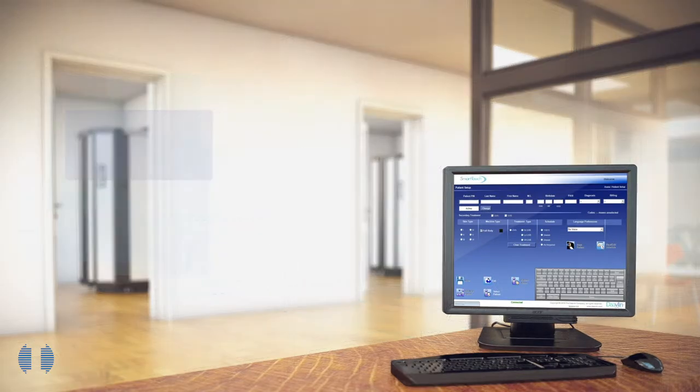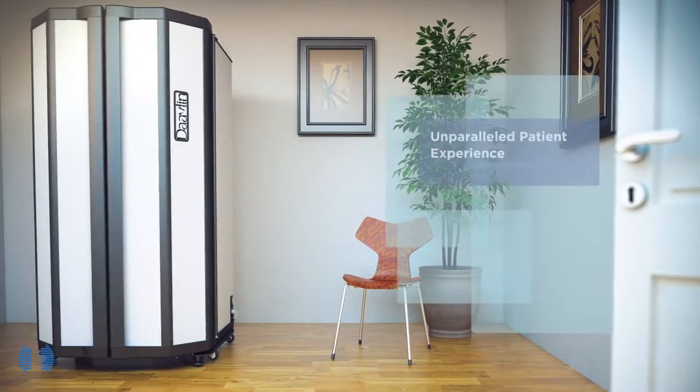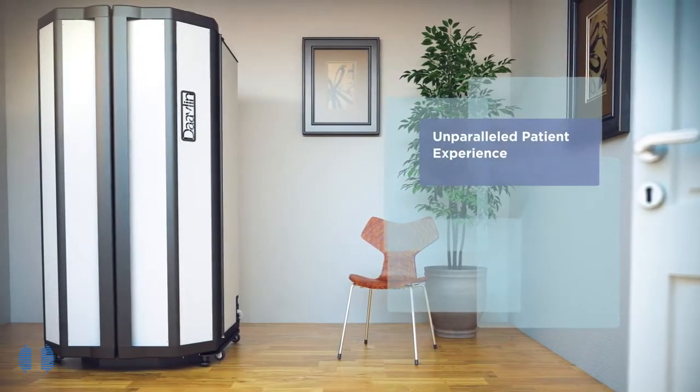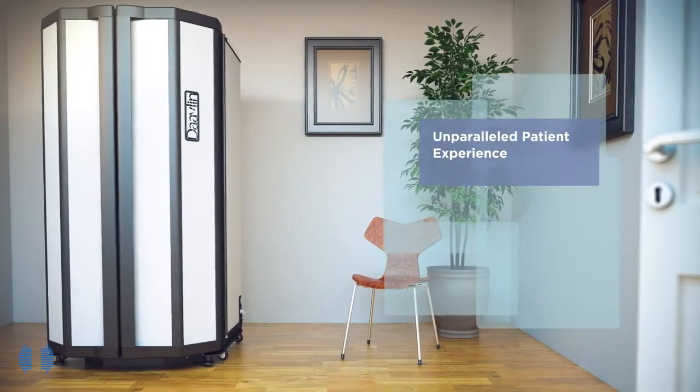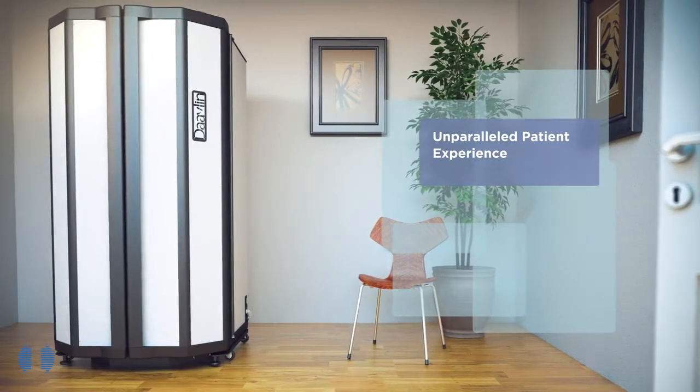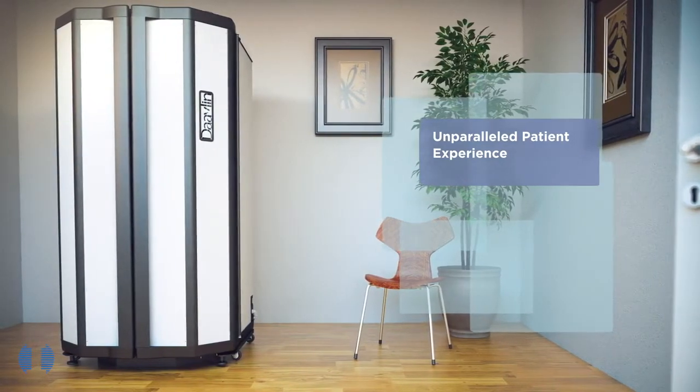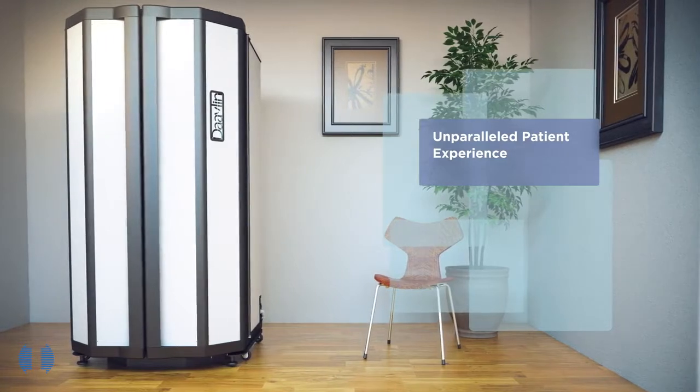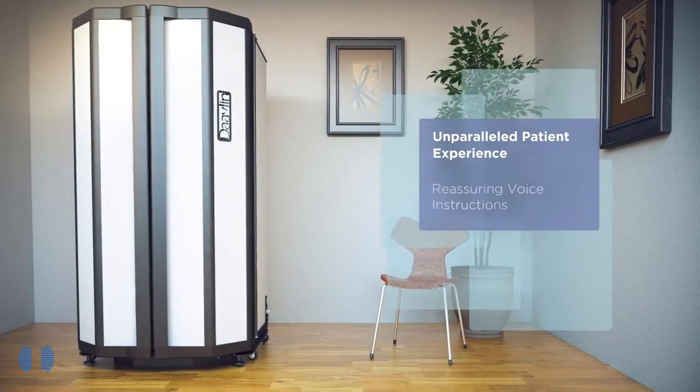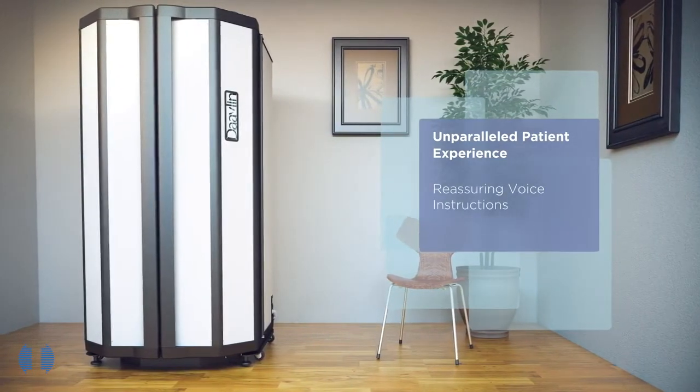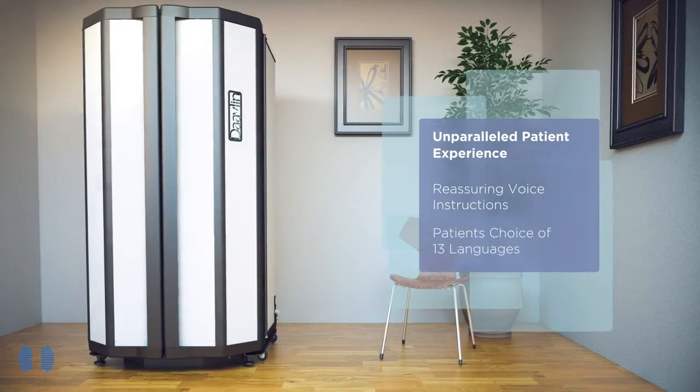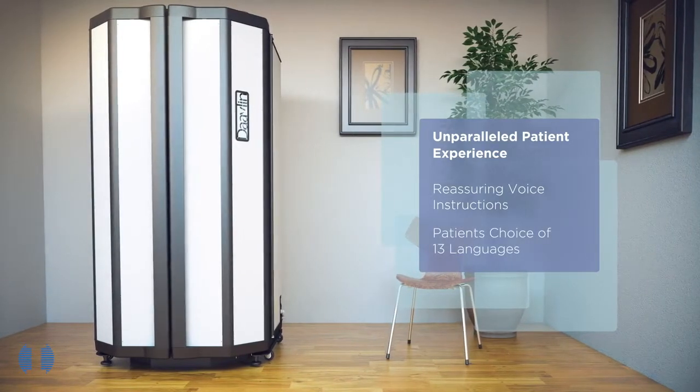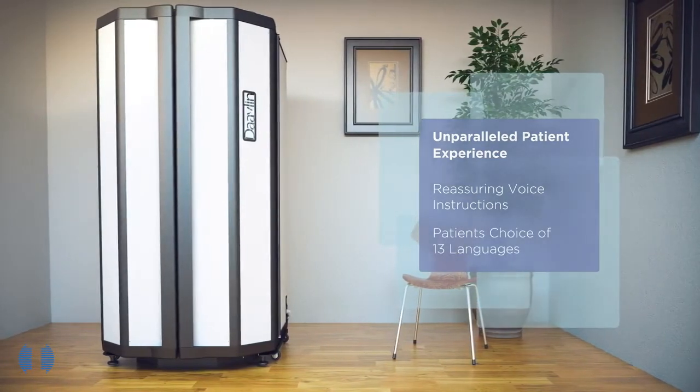Thanks to Smart Touch, the patient experience is unparalleled. The system talks to patients, telling them what to expect as they begin treatment and keeping them informed about how much time remains during treatment. These reassuring voice instructions can be delivered in the patient's choice of 13 languages in a soothing male or female voice.